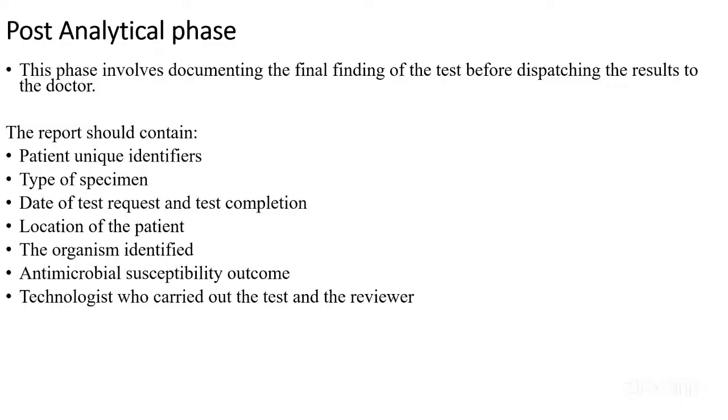Was the patient an outpatient or is it an inpatient? And then we should be able to see in the report which organism was identified, the whole name, the species name. Then we should be able to see the antimicrobial resistance outcome. We should be able to see which drug was sensitive, which drug was resistant. We should have all that information. And last but not least, there should be a technologist who has signed off their name and signature, and also a reviewer of that report.